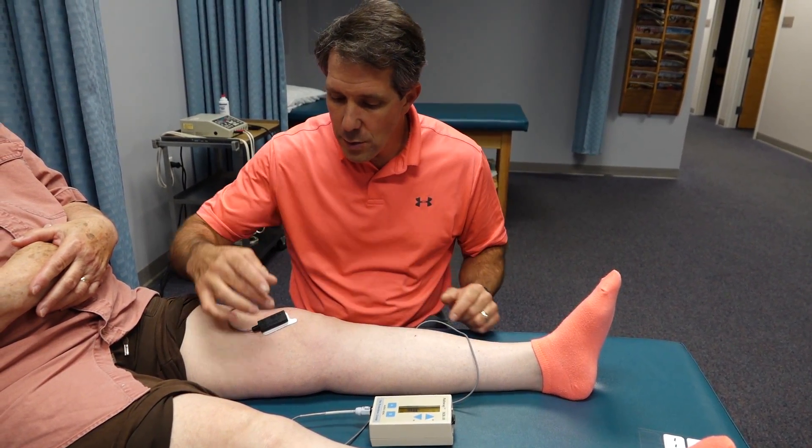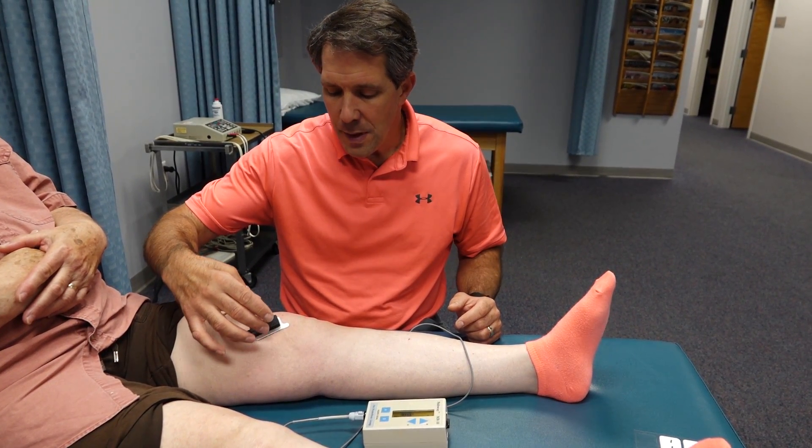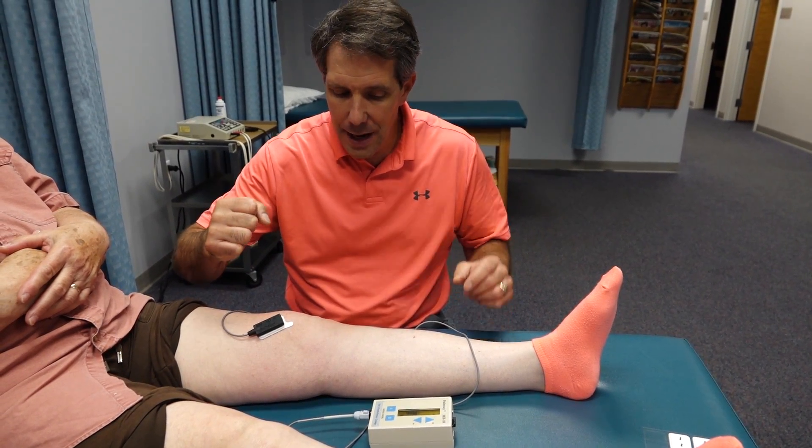So what we did is we placed the biofeedback patch along the fibers of the VMO, and we're just trying to get her to tighten that up.